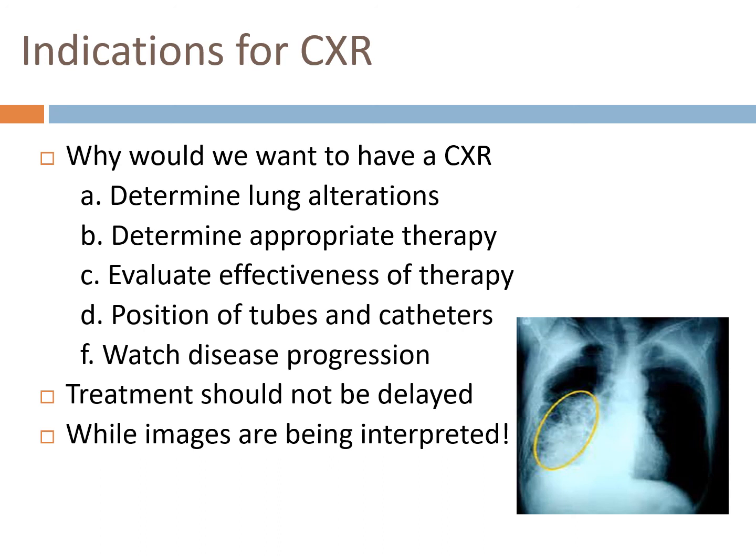while the images are being interpreted. The great thing now with our X-ray ability is that if they come up to do an X-ray, and especially if it's something that needs an intervention by a physician, like a chest tube put in, often they are there. And when they do the X-ray now, they have a little computer screen right on their machine that's able to give them a really quick view, a small view, of some really gross abnormalities that are going on. So they don't necessarily have to wait for it to be officially interpreted to make a decision on treatment.